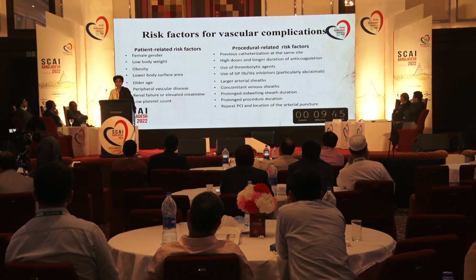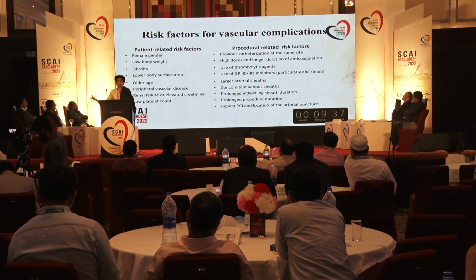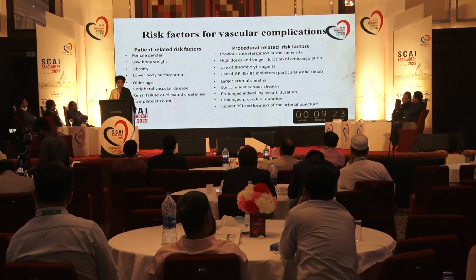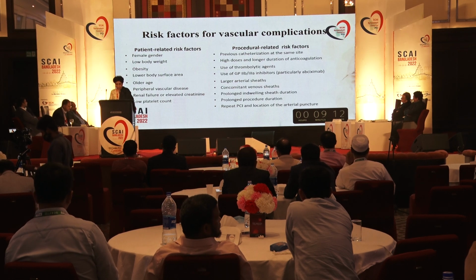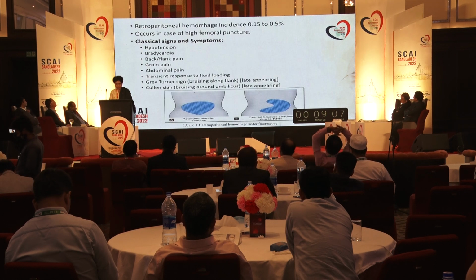The use of thrombolytic agents, maybe the patient had a thrombolytic agent given just previously, and in our country we tend to use streptokinase. And the next day you're doing a pharmacoinvasive procedure. So in that case, give your heparin at the lowest possible dose and then step it up. Otherwise, bleeding can happen. Use of GP2B3 receptor blockers, larger arterial sheaths, especially 8 French catheters, concomitant arterial and venous sheath, prolonged indwelling sheath duration, prolonged procedural duration, and if you do multiple punctures. So all common sense things that we know.